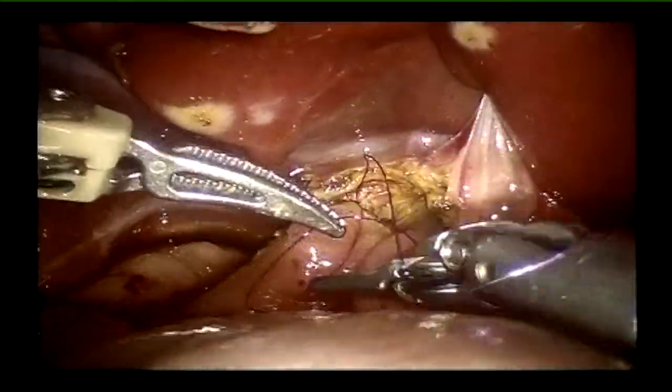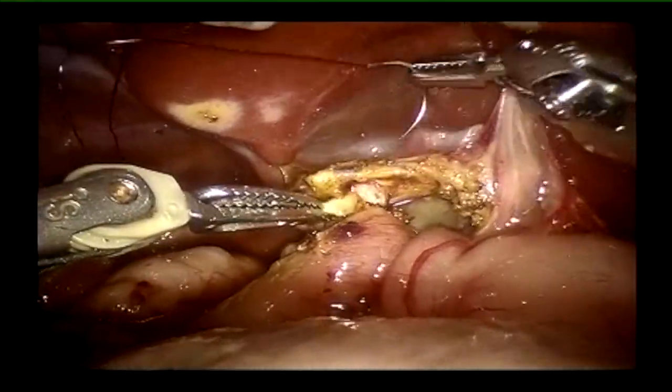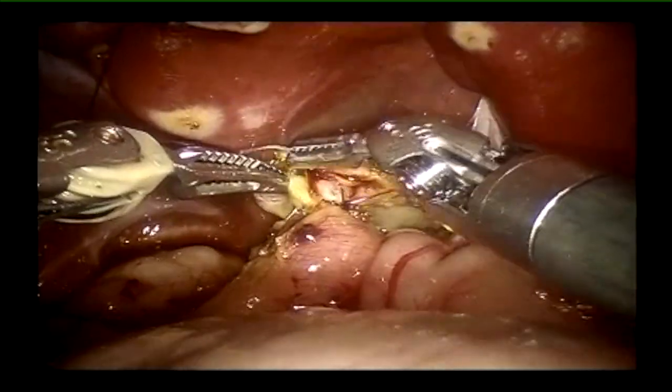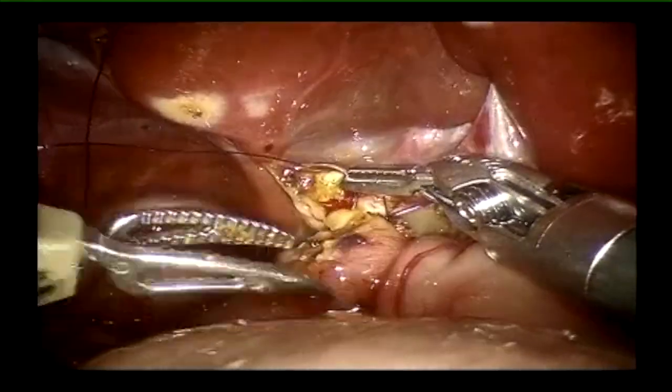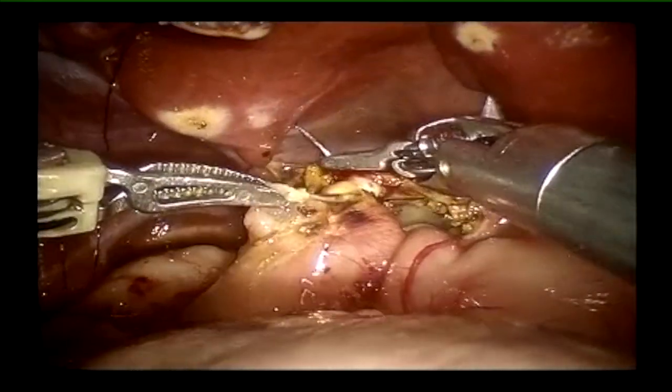We suture the anastomosis with 5-0 PDS in a single layer. With good results so far, we haven't had any anastomotic problems in the long term in any of our patients.